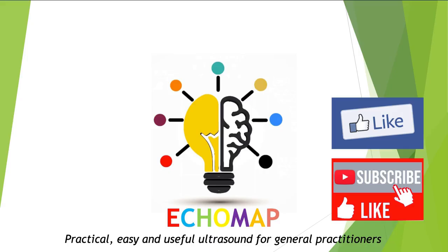Today, we're going to talk about lymph nodes, about suspicious lymph nodes, and lymph node tumors.